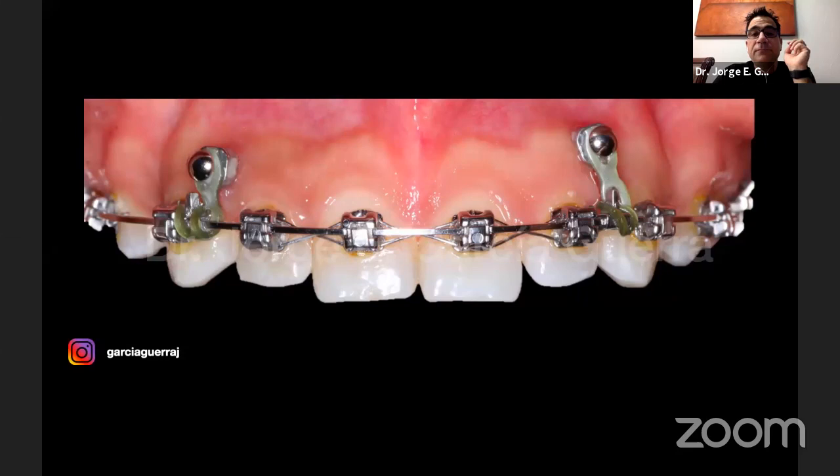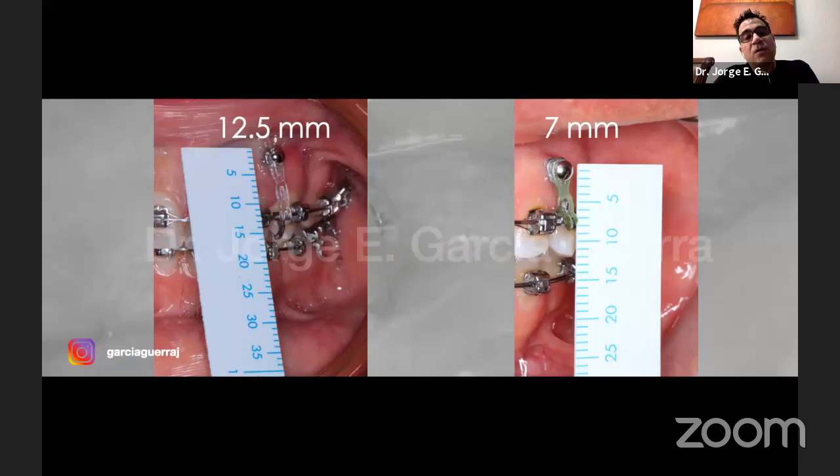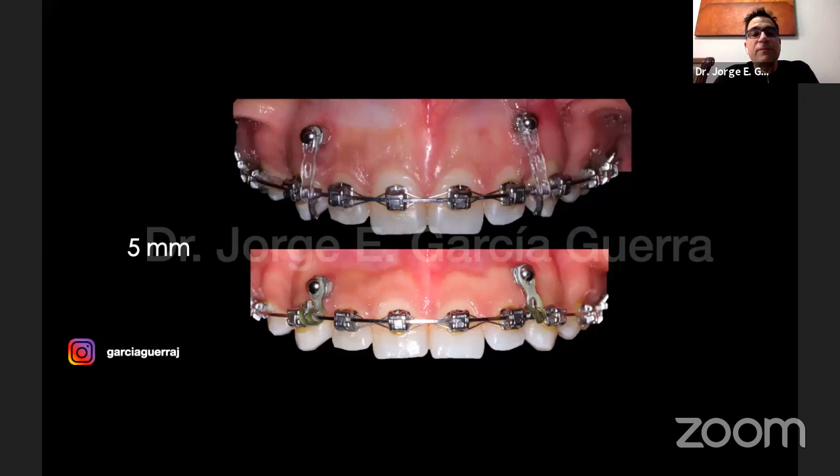And this is a picture at the beginning. We had 10 millimeters of distance between the mini screw and the arch. And at the end, we have 5.5. But the majority of that intrusion is also inclination of the incisors. You're going to see another picture. This is the left side. It was at 12.5 at the beginning. And here we have 7 millimeters. It was practically 5 millimeters from the beginning to the end.